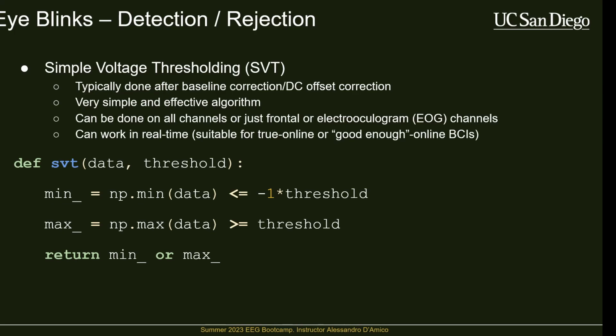It's going to be on some arbitrary voltage. And baseline correcting essentially centers everything around 0 so that your oscillations are going from like plus and minus 10 microvolts instead of 22,000 microvolts to 22,000 minus 20 microvolts. That's the main reason we're doing that.